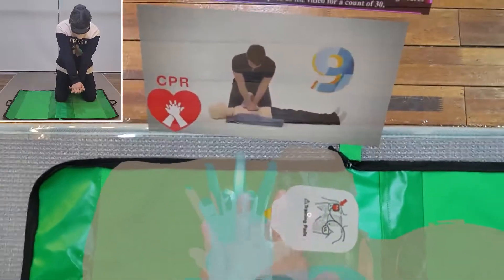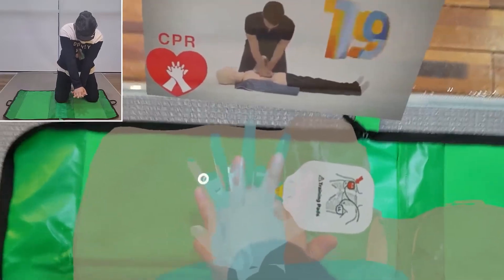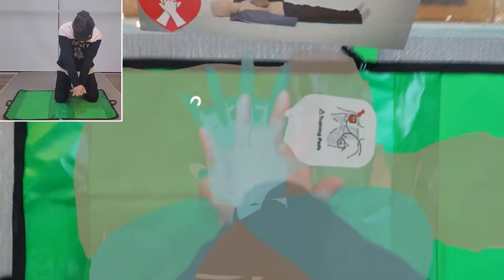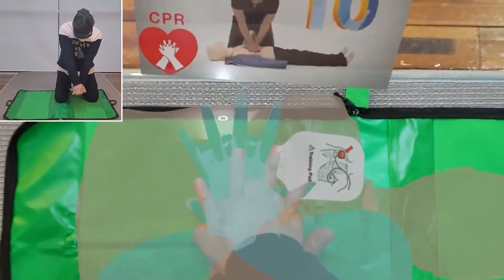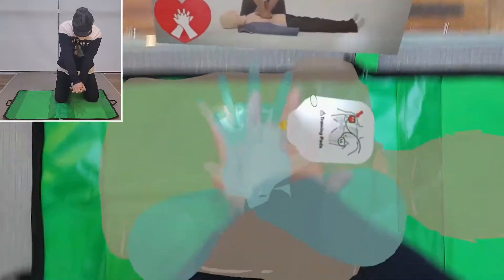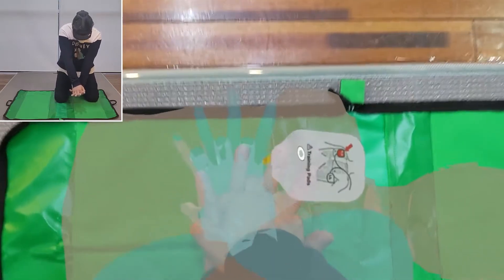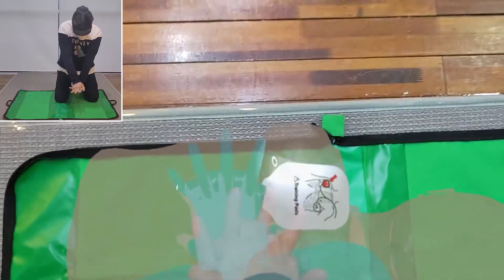Begin CPR immediately. After the defibrillation, CPR should be resumed immediately. In the same manner as before, follow the virtual hand gestures and perform compressions at the same pace as the video for a count of 30. If the person performing CPR is struggling, take turns so that CPR is not interrupted. It is best to alternate every two minutes when the AED is restarted. Repeat CPR without stopping until paramedics arrive.